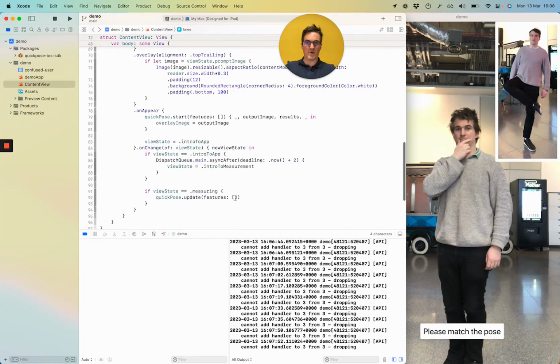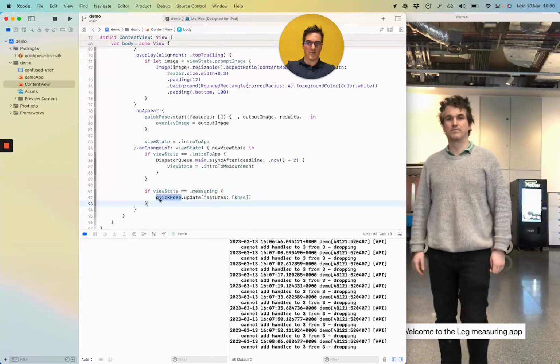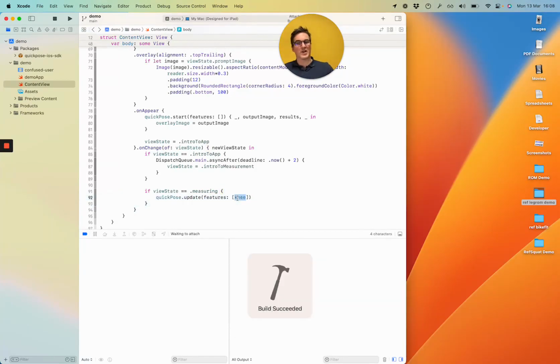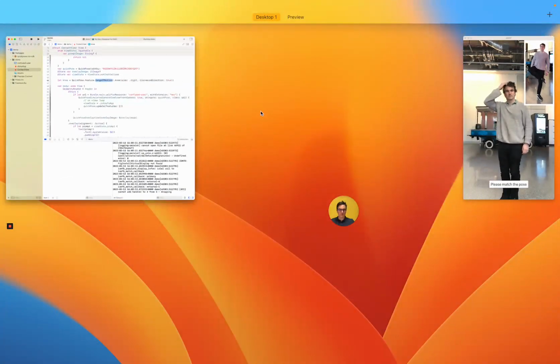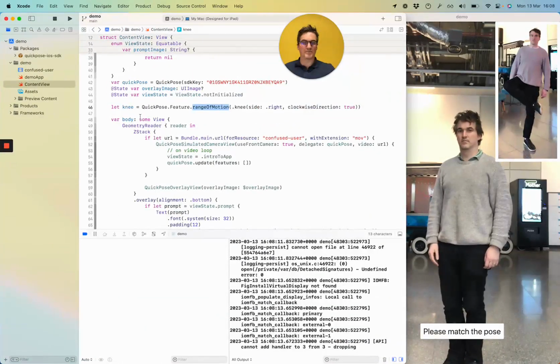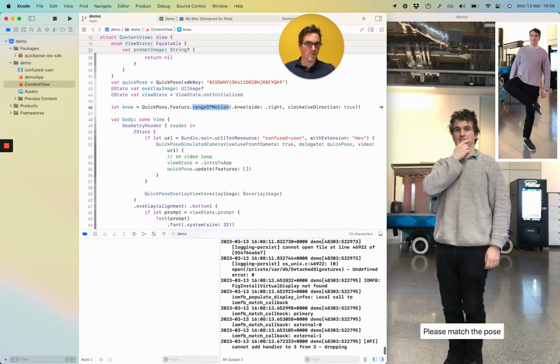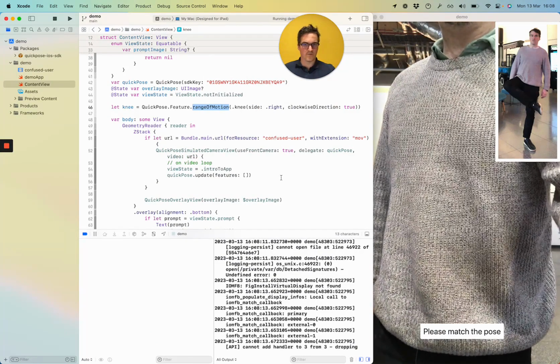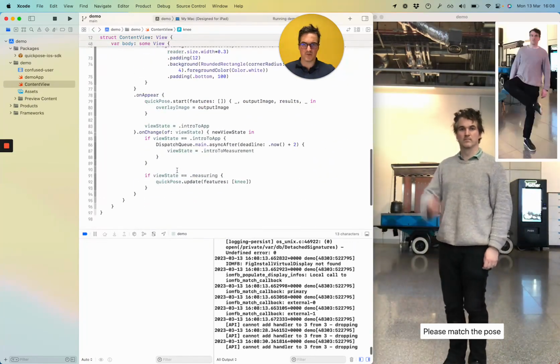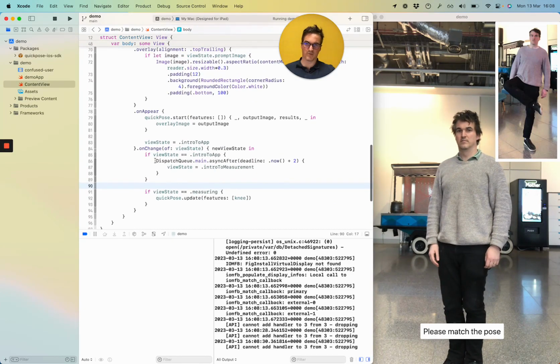So now, whenever my view state is set to measuring, the QuickPose SDK is updated with a knee range of motion feature. If you're wondering what these are, we show them all on GitHub, so you can see the whole range of features, and that will grow as more and more releases come out. Okay, what have we got going on here? Please match the pose. I was expecting a range of motion to be shown there, to be honest. Oh, nowhere is it going to show range of motion. Got you.